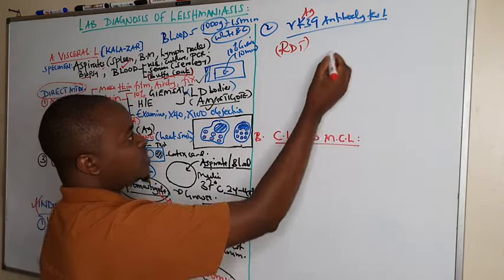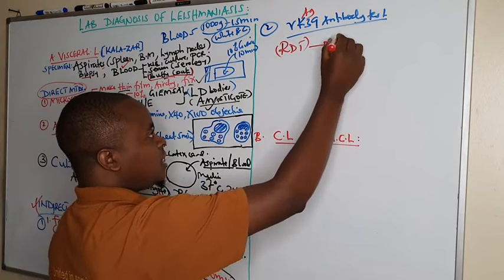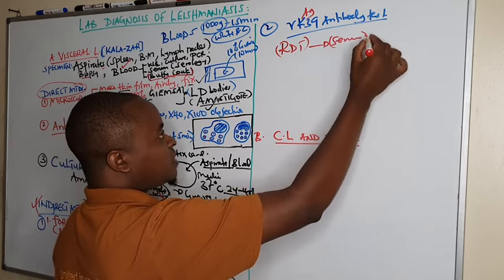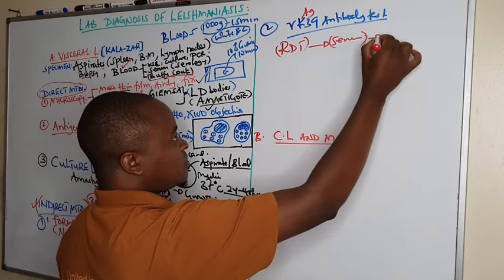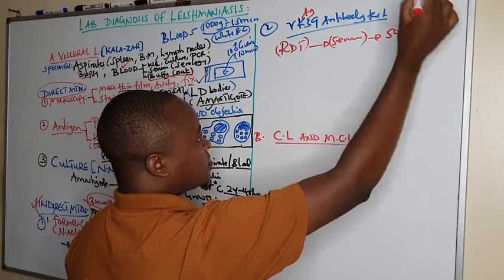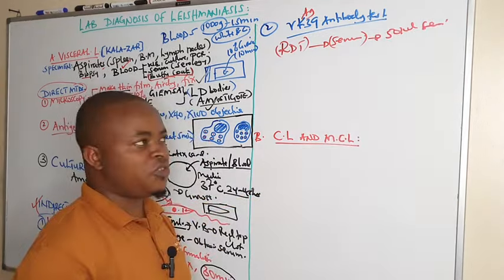This is a rapid test, acting as an RDT, and it is commonly used by researchers in resource-limited areas, detecting the presence of antibodies in the patient's serum. You just prepare the blood, obtain serum in the field, and add about 50 microliters of serum to the kit. Then you time per the manufacturer's manual.